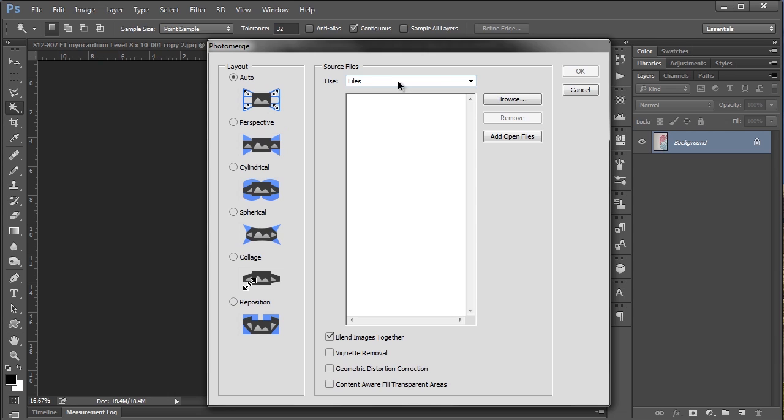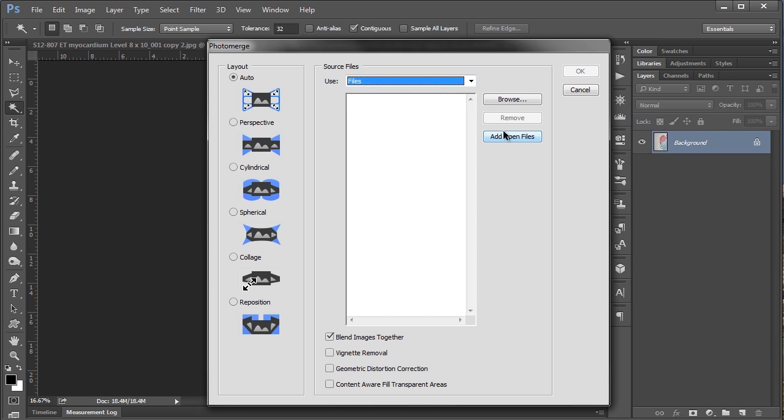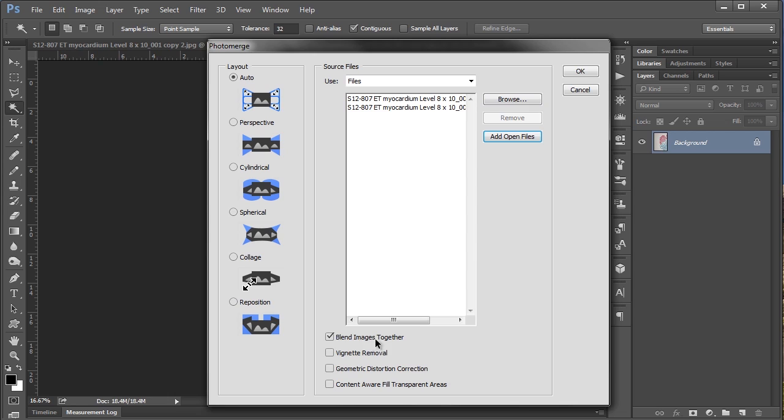We're going to use files as opposed to using a folder. And because I've already brought the images into Photoshop I'm just going to say add open files. But you can get to them by clicking this browse button and navigating to the appropriate place. We have a couple of options on the bottom here. Which some of these were introduced in later versions of Photoshop. At least later from CS3 which is what I've used previously.